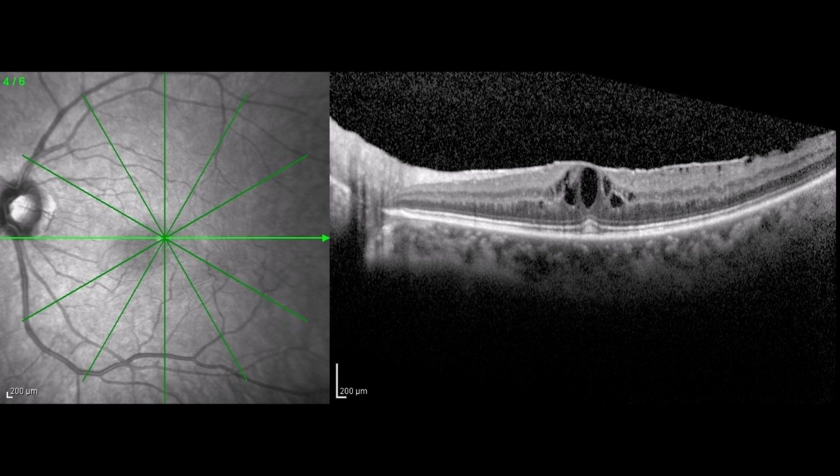This, for a number of reasons, is fairly pathognomonic. You see this concavity to the sclera, so you're automatically thinking myopia, staphyloma, something like that. You even see this artifact in the upper left corner where part of the image went outside of the register and then gets reflected back into it. Then you see a little bit of an ERM, but you see all these fluid spaces that are fairly radial in orientation. This is a very common presentation for myopic traction maculopathy, myopic retinoschisis. It's got probably about 5 or 6 other names.